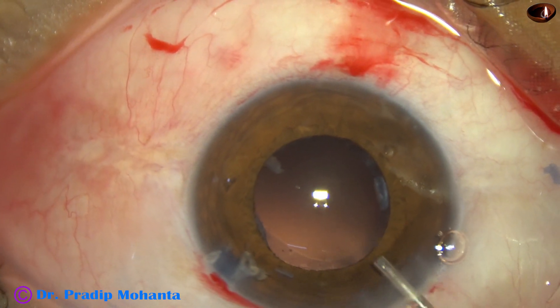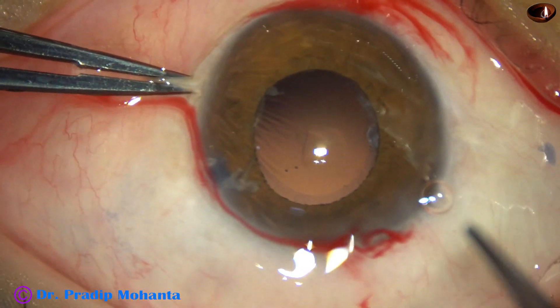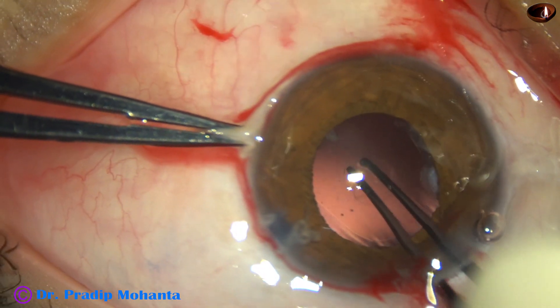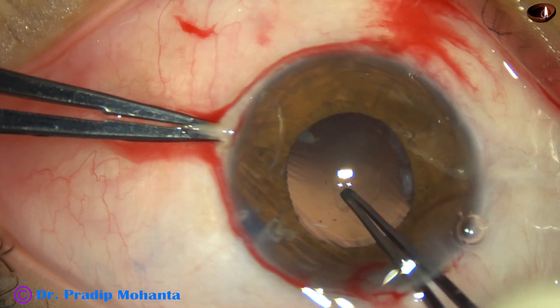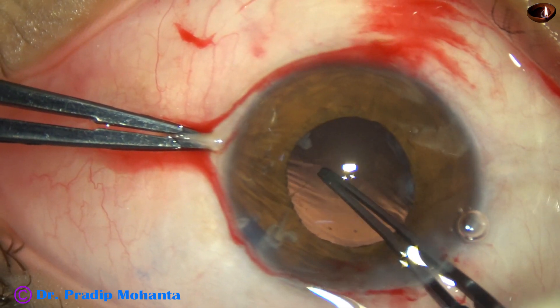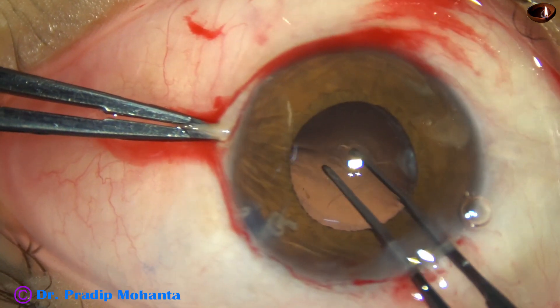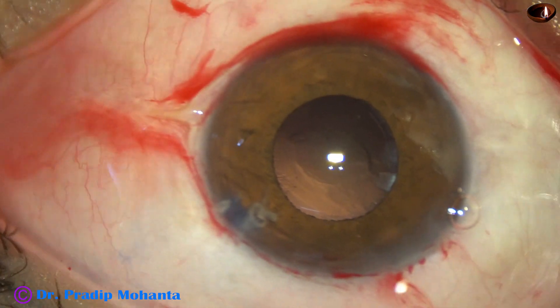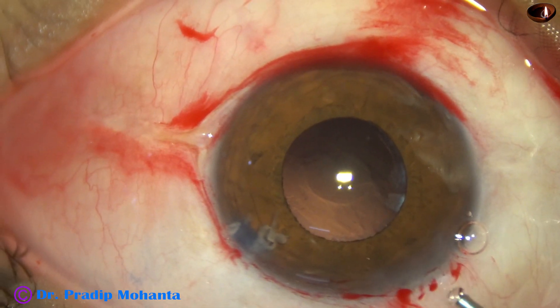What to do now? Unless I convert this rent into a PCCC — Posterior Continuous Curvilinear Capsulorhexis — it will suddenly enlarge to one side and the lens cannot be placed in the bag. So to place the lens in the bag, I just did a PCCC. And I find that there is no vitreous prolapse in the anterior chamber. Inject some more visco.